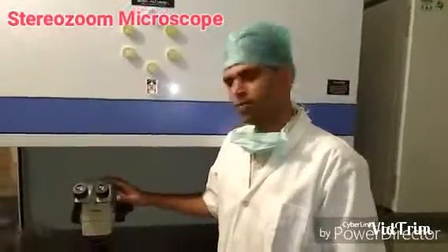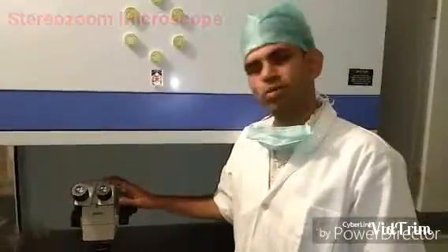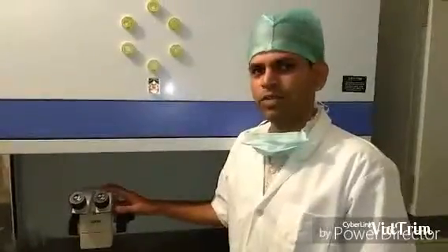The StereoZoom Microscope is used for performing most of the procedures in IVF lab, which includes screening of eggs during egg collection, insemination of eggs for conventional IVF, denuding of eggs for ICSI, freezing of eggs, freezing of embryos, and loading of embryos into the catheter for embryo transfer.